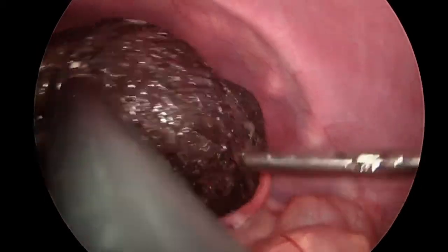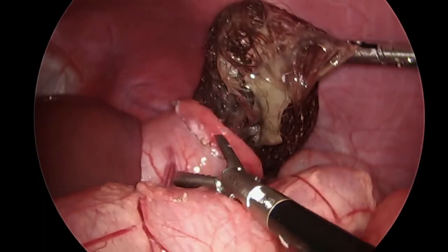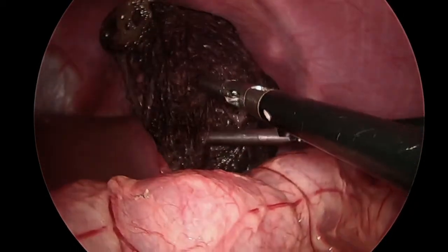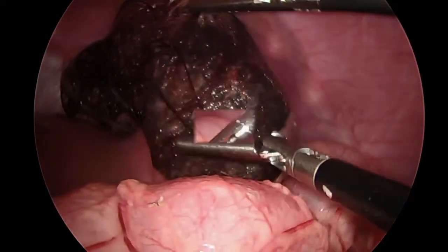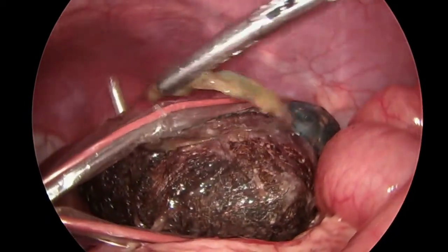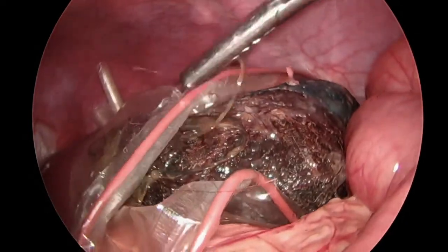Patience and careful manipulation at this stage will ensure the size of the gastrotomy and hair spillage into the peritoneum is minimized. The trichobezoar was placed into a laparoscopic bag, again to help minimize hair spillage into the peritoneum, as attention turned to closure of the gastrotomy.